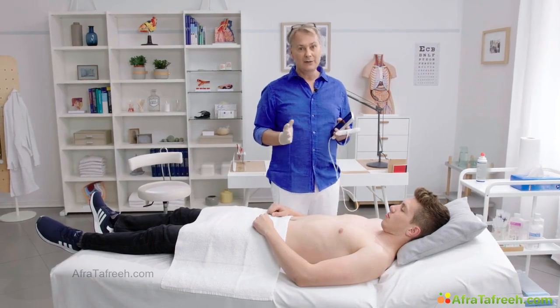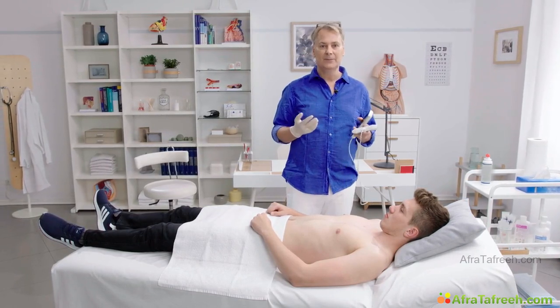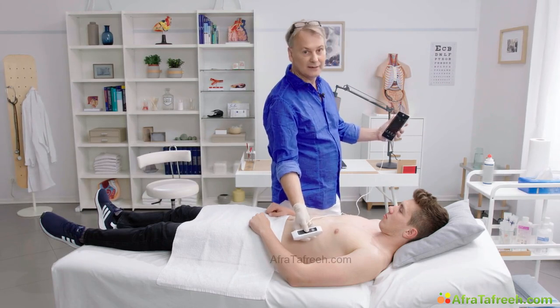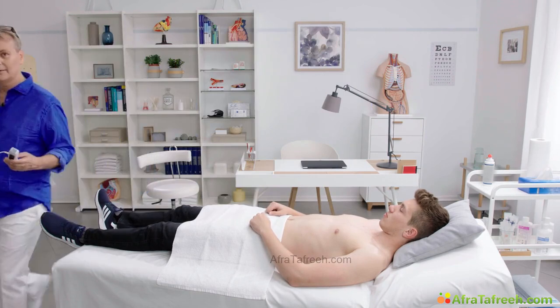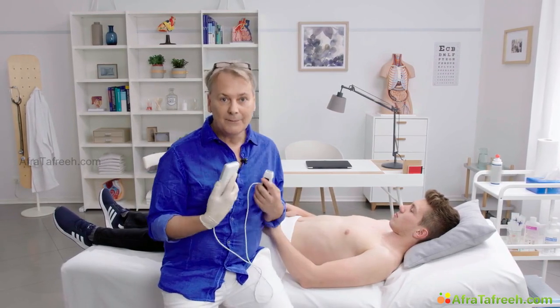In principle, when we image, we have two different positions from where we can image the patient. One is from the right side, and the other is from the left. From the right side, you'll be using the right hand to image and the left hand for the device. If you image from the other side, you would be using the left hand and the right hand for the transducer. Now, I personally have been trained to image with my right hand, so that's what I'm going to do.